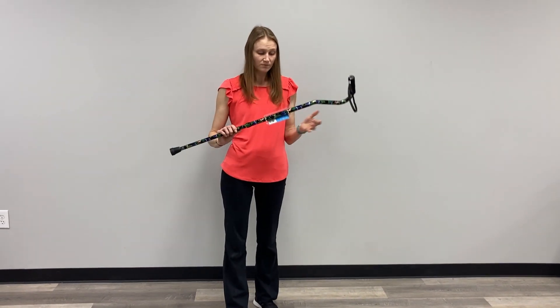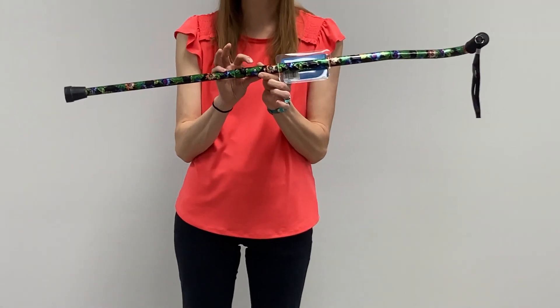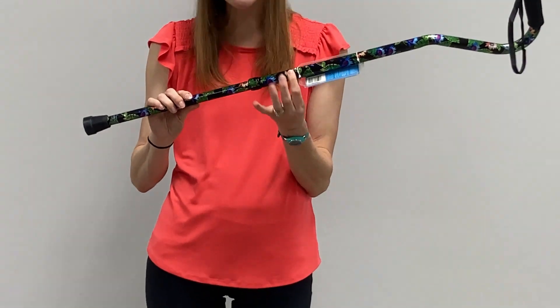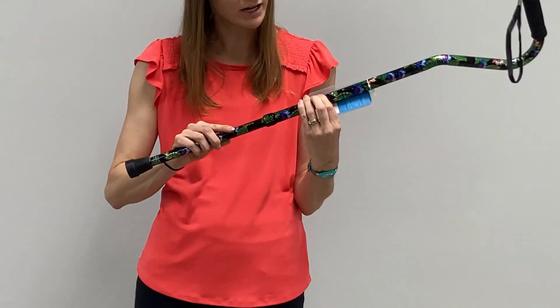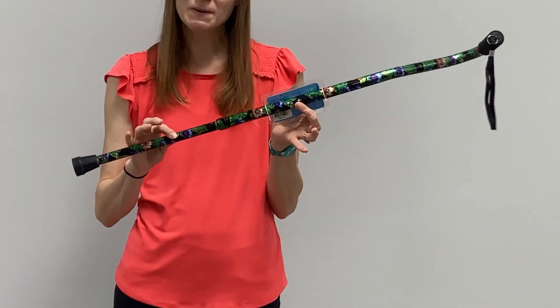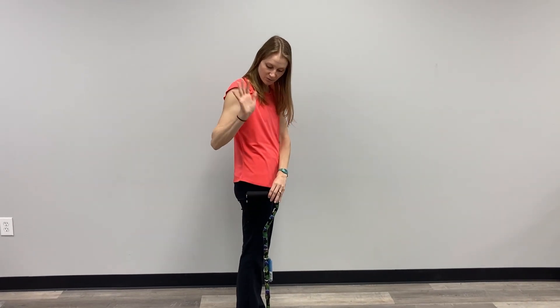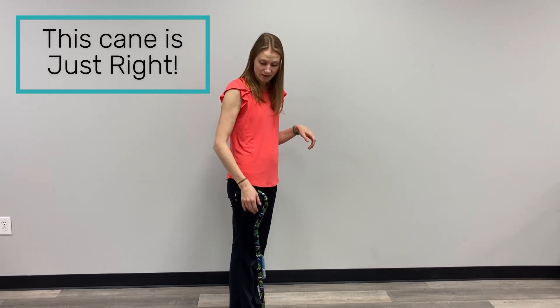To adjust your cane, we are simply going to take our cane — they adjust using this push-button system. Here is my button right here. I am just going to give that a push and scoot it up one notch at a time until I get to a place that I think I may want to try for height. I am going to put my cane right here in this position, give it a try, and see how it looks. Now that I have made my adjustment, I am going to stand at my side with my cane next to me, and it is hanging at the height of my wrist.